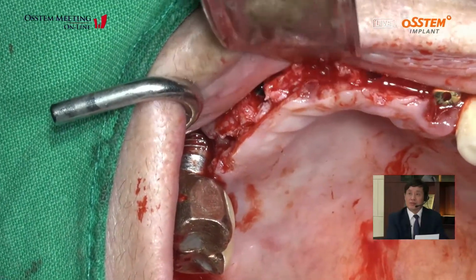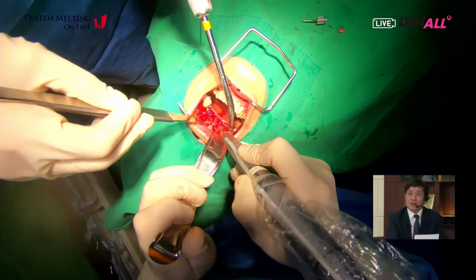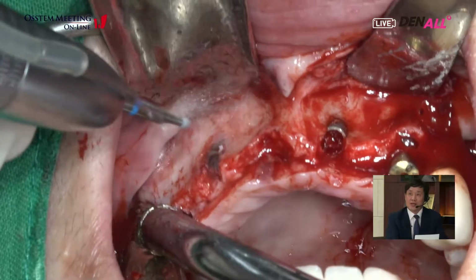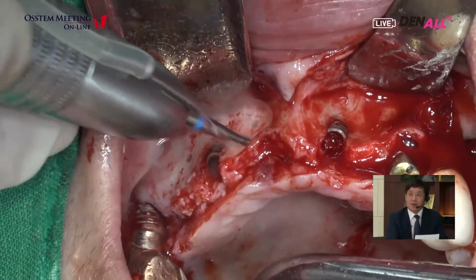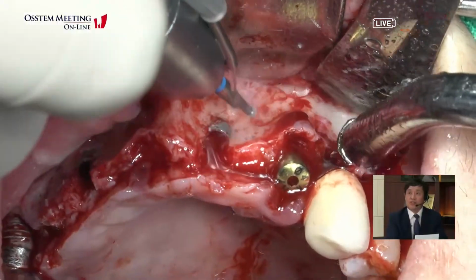He will do the GBR in the anterior areas. Cortical perforation will be done to get blood supply. Yeah, he did the cortical perforation for the blood supply of the graft materials.